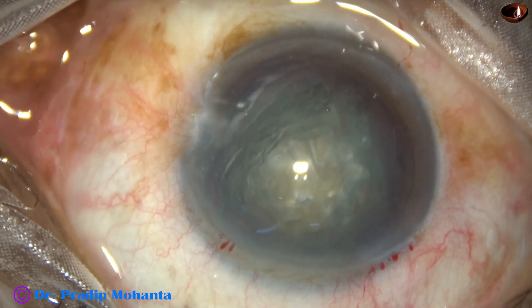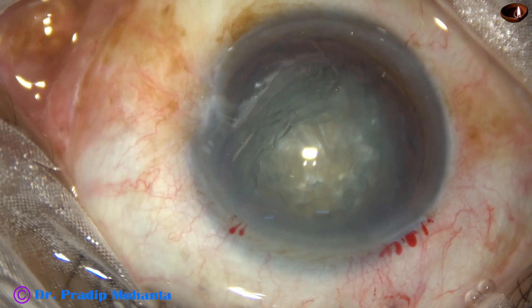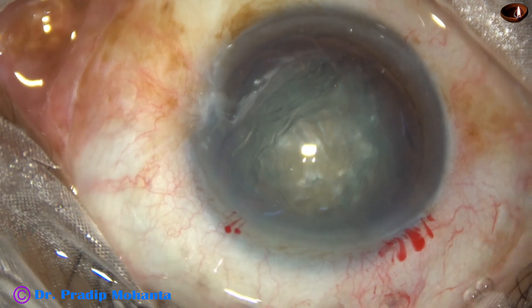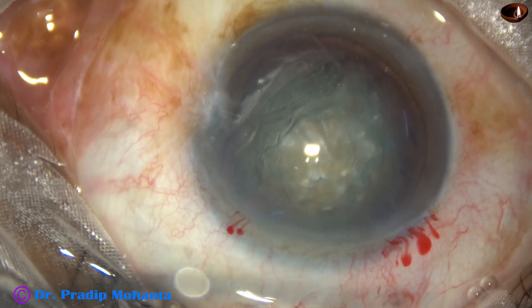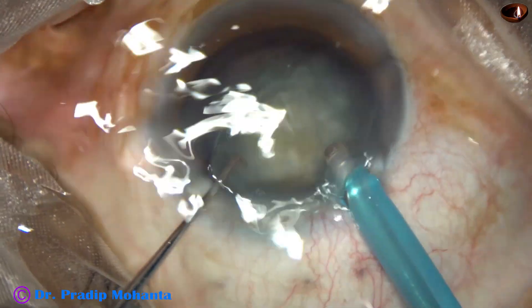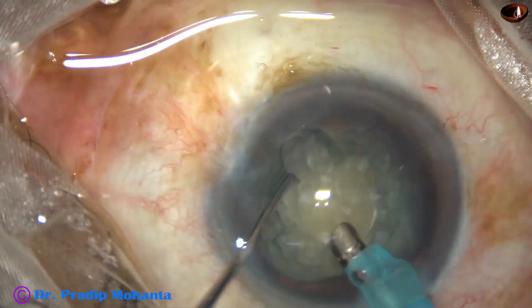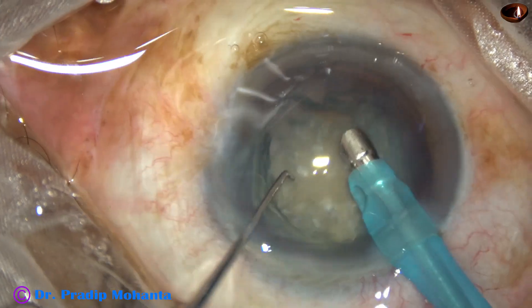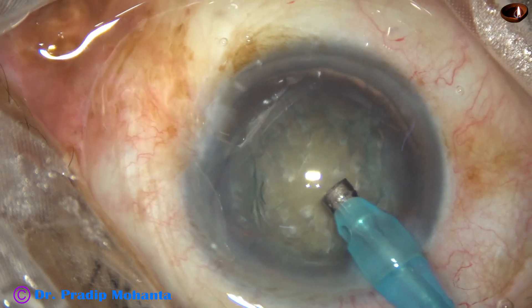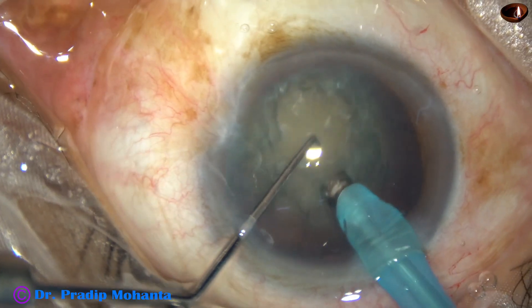Some more visco. And now is the time to introduce the phaco needle. The machine being used is Infiniti from Alcon, and I am going to do the divide and conquer technique in this case. Some superficial lens matter is aspirated so that we get good visibility. Now the handpiece is turned to make the bevel up, and I am ready to do the trenches.